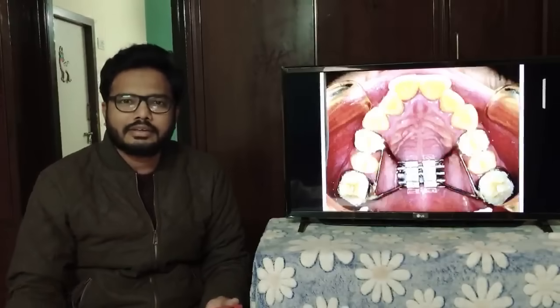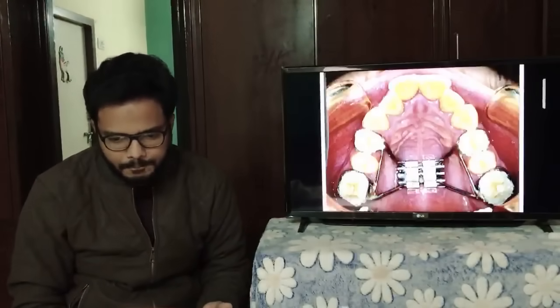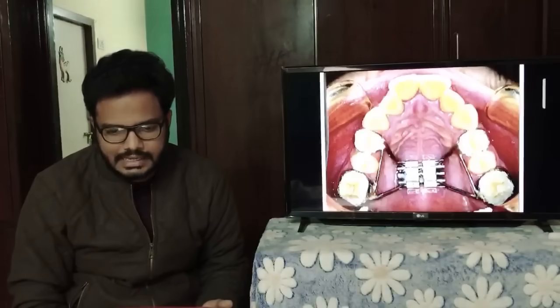Wonderful. Rapid maxillary expansion, Hyrax appliance. Can you tell what Hyrax stands for? This is Hyrax. It's a special kind of screw. It's used for arch expansion. Good. Yes, Ankit, hygienic rapid expander. Good. Helps in rapid maxillary expansion.